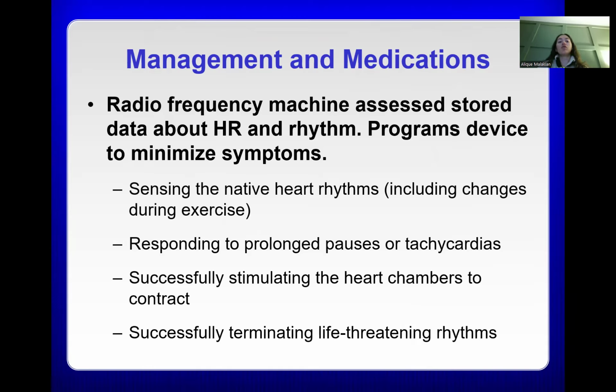And the four main goals for this whole process are: first, sensing the native heart rhythms, including the changes during exercise. Two, responding to prolonged pauses or tachycardias. Three, successfully stimulating the heart chambers to contract. And four, successfully terminating life-threatening rhythms. So I thought this was pretty cool. The little pacemaker keeps all of this information, and the doctors work with the individuals to program devices to their needs. I think that's really awesome. Says a lot about where we've gotten in the past several decades with all this technology.